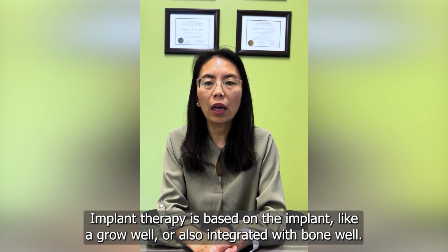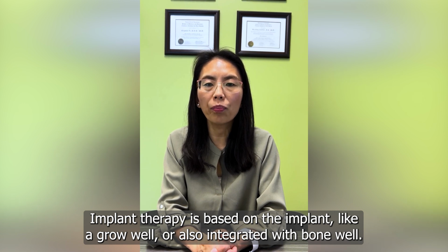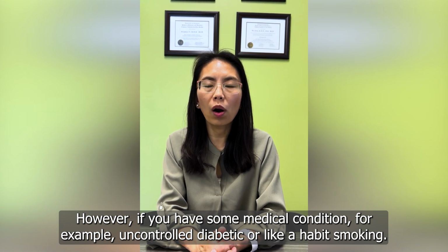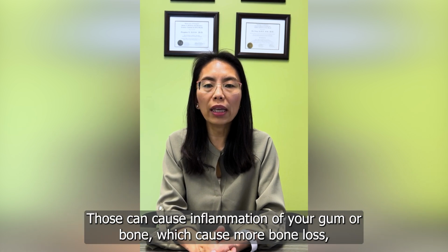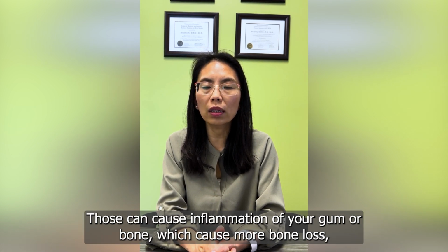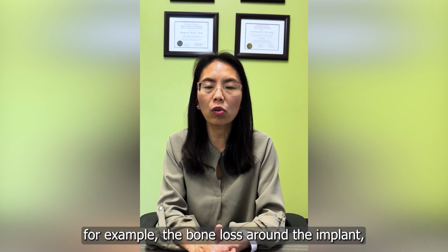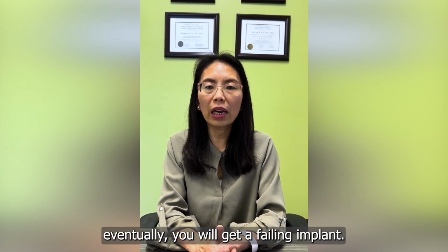Implant therapy depends on the implant growing well and integrating well with the bone. However, if you have some medical conditions, for example uncontrolled diabetes or heavy smoking, those can cause inflammation of your gum or bone, which causes more bone loss. In the long term, the implant may get biological complications, for example bone loss around the implant. Eventually, you will get a failing implant.